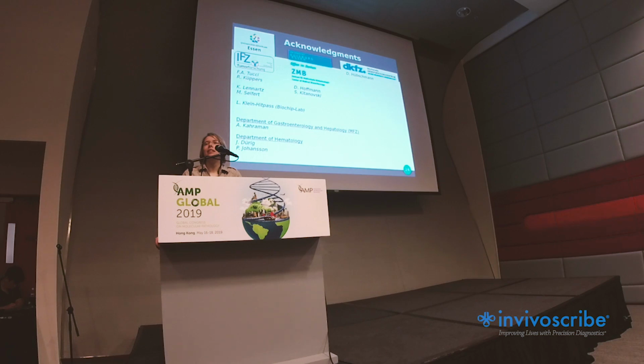Well, the number of primers is proprietary information. You know the BIOMED-2 primers, BIOMED-2 technology, right? So we amplify the same regions, but the sequences and the number of primers, that would be proprietary information. That's fine, but how big? Oh, she's testing framework 1. Yep, only. So the amplicon size will be around 300 bases.